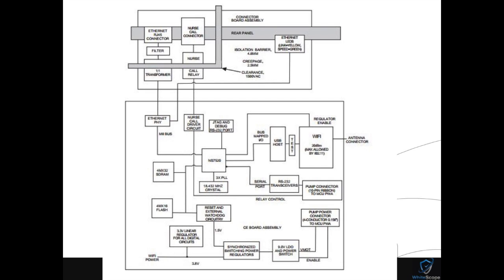And so when we look at this piece here, we see there's this NetARM processor for the communications module, but this is only one piece of this pump. This communications module communicates over serial to another set of components, right?